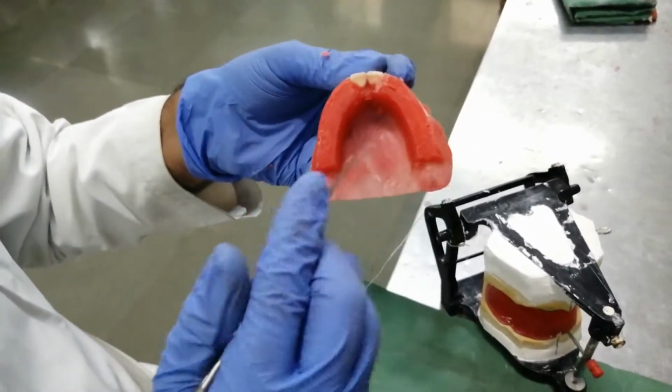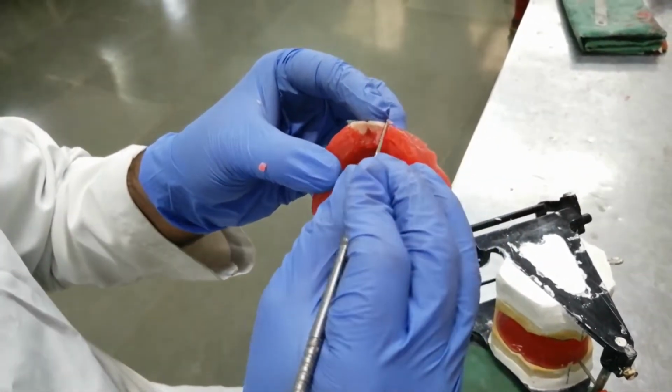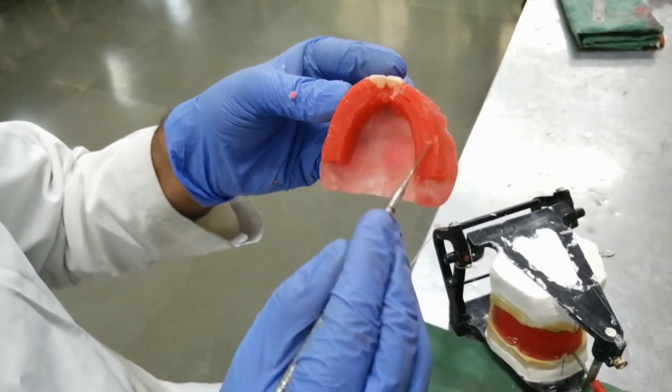You have to make sure that central incisors' incisor edges are making the curve and they are on the same line. Incisor edges should run along the outer edges of the maxillary rim.